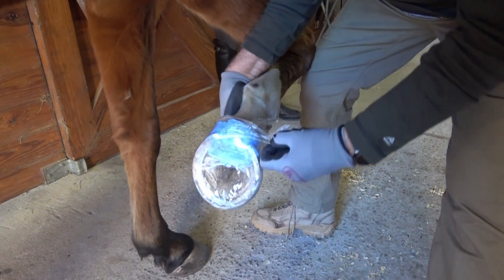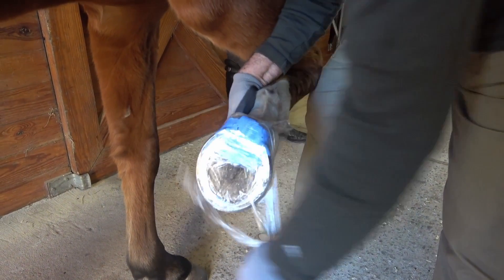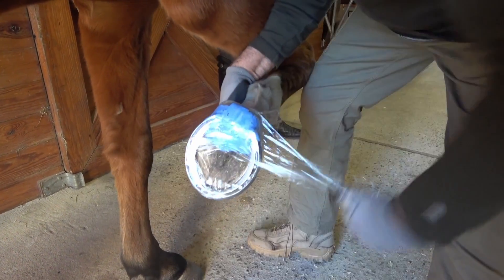Once the impression material has set up, you can easily unwrap the foot and trim away any undesired pieces or high spots if necessary.